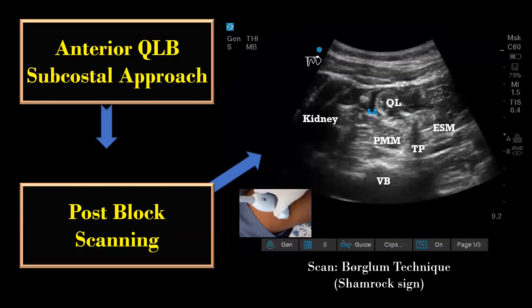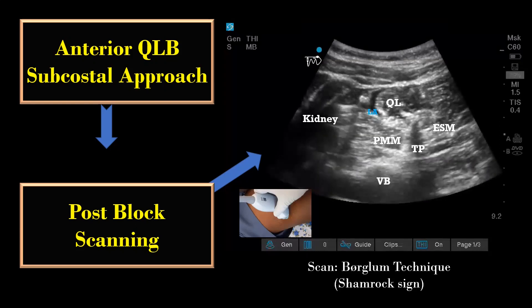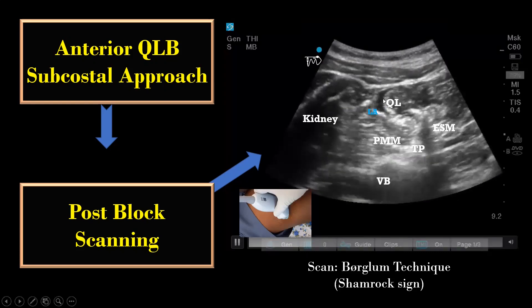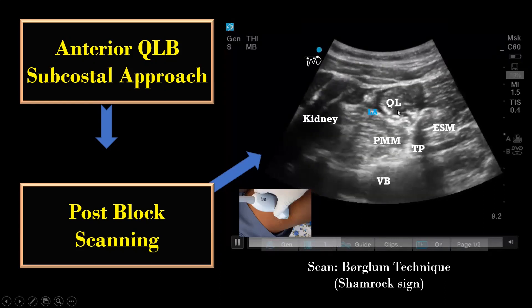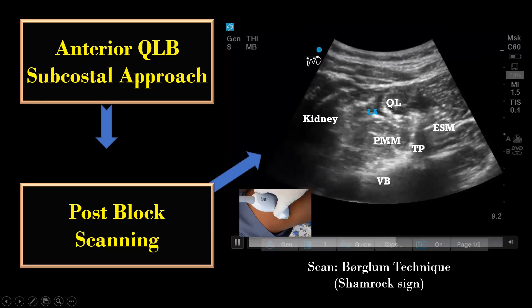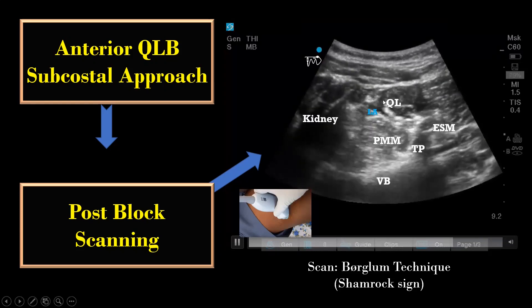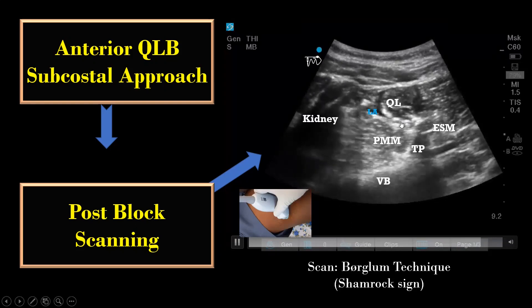Following the performance of subcostal quadratus lumborum block, if we scan using the Borglum technique — which we use to perform the transmuscular approach of anterior quadratus lumborum block — a nice layer of local anesthetic is visible lateral and anterior to the QL muscle, in between the QL and the psoas major muscle, which again confirms correct deposition of local anesthetic.